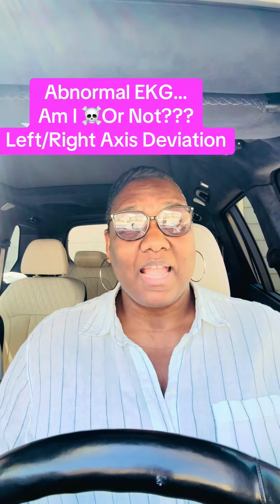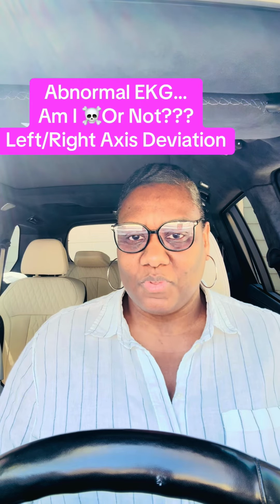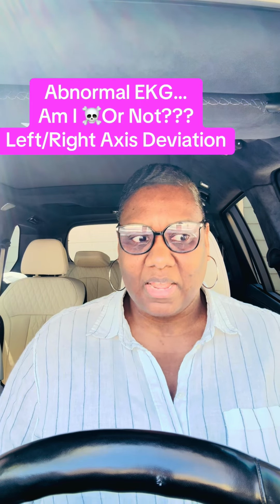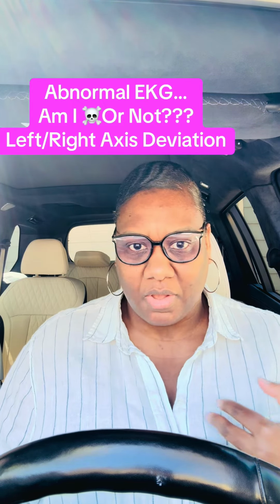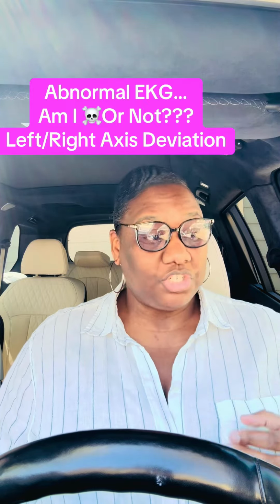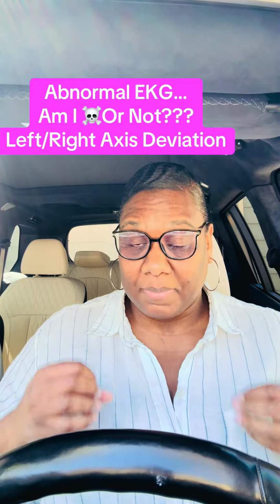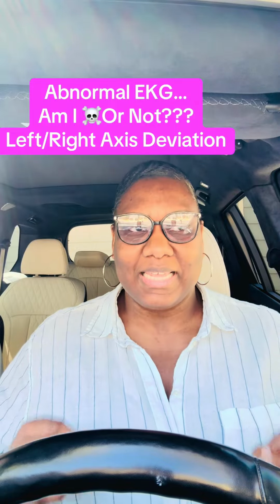As always, my first piece of advice is if you get any sort of abnormal finding on the machine read of your EKG, take all those stickers and leads off, prep your patient's skin a little bit better, and ensure that the electrodes are in the places where they are supposed to be, to include the limb leads.